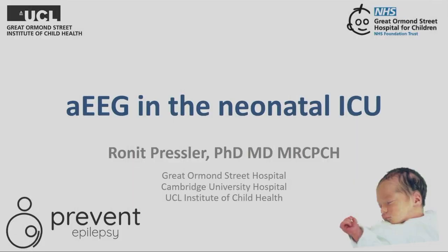I'm going to talk a bit about aEEG, because that is what we will display for you while we record the EEG. So the EEG is set up with all 11 channels and the video, but for displaying during the time of the recording, you see the aEEG, which you will be able to use for the management of the babies.